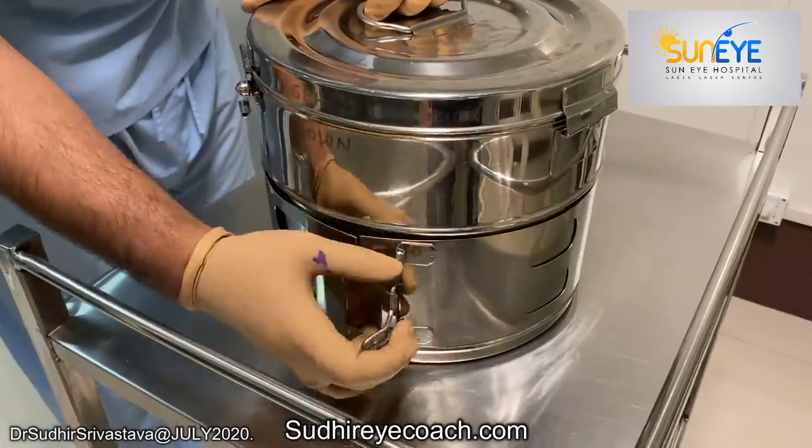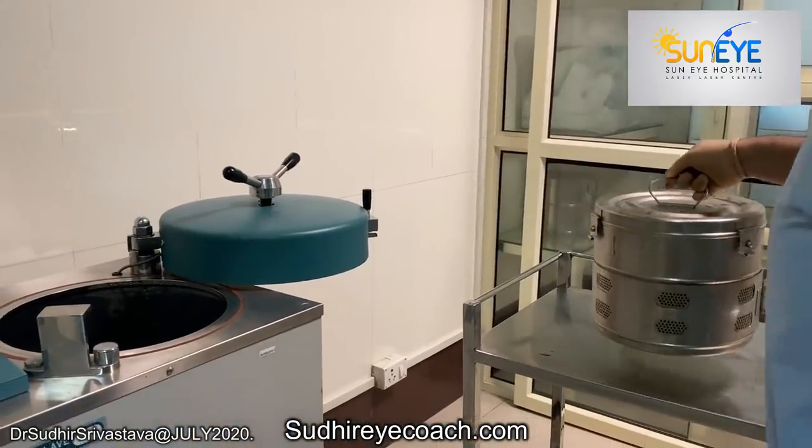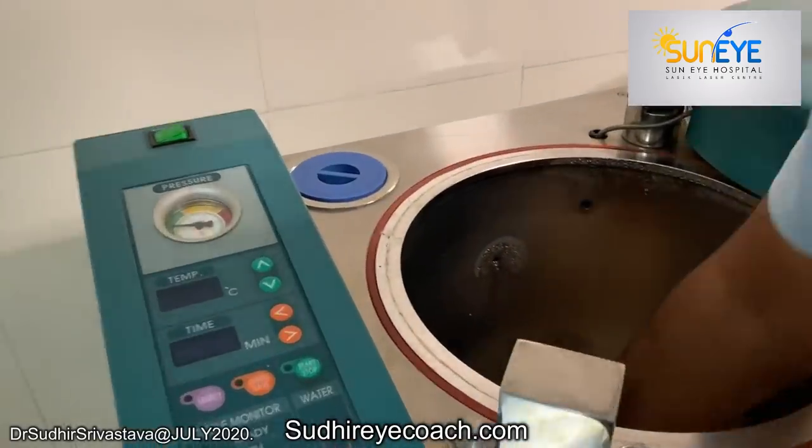There are several ways of sterilization, out of them autoclaving is the most trustable. Whether our autoclave is properly working or not, we need to do daily steam sterilizer monitoring.